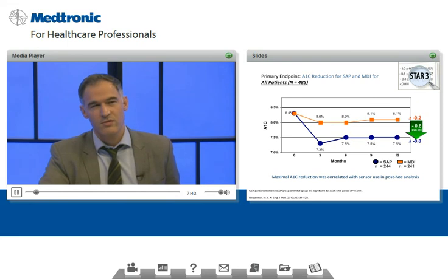Now just maybe note that both of these groups used CareLink, an online resource for uploading and interpreting and reviewing data. Both these groups had full standard of care, but they were a group of patients who were failing to reach targets at the beginning.